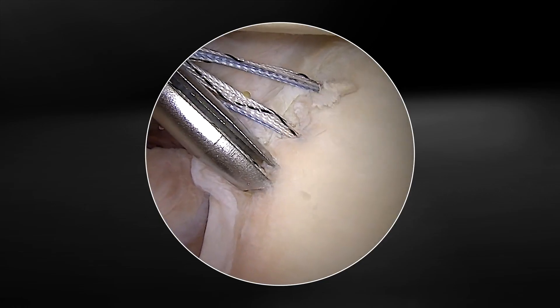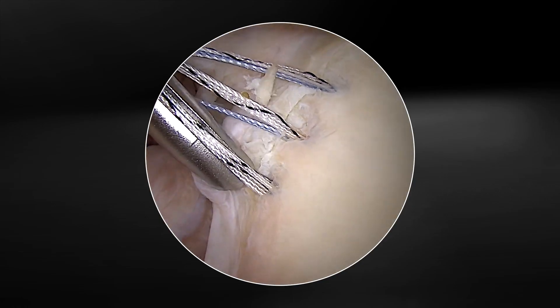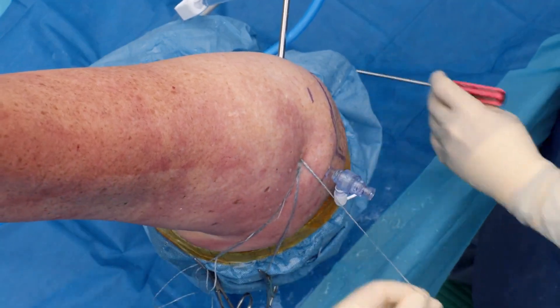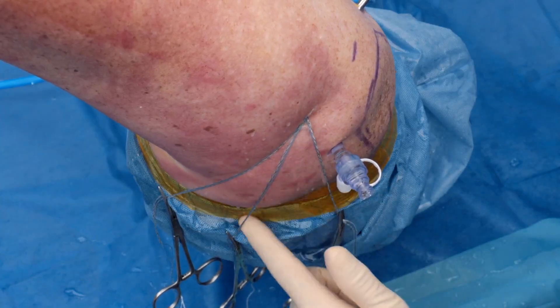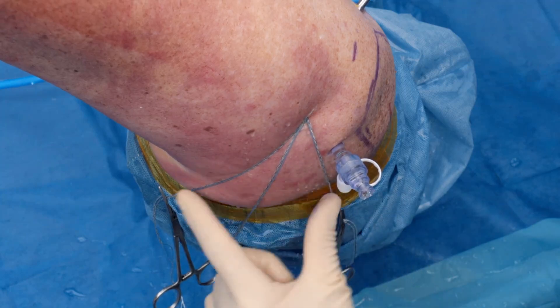Insert your final anchor, disengage the sutures, and now you can remove the guide. With the guide removed, I think it's best to clamp all three anchor sutures to keep them organized to assist with suture management.